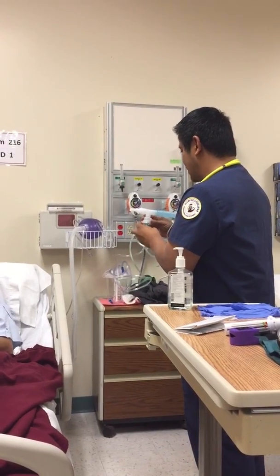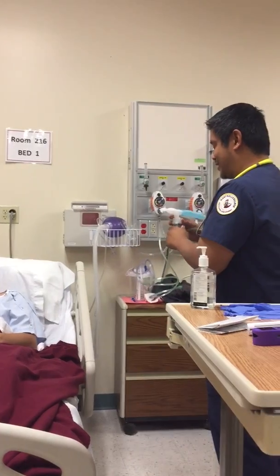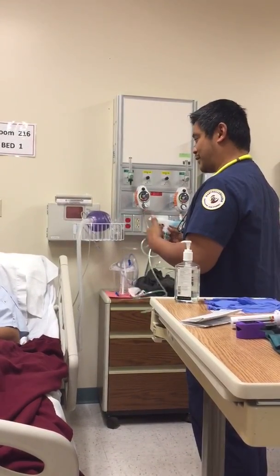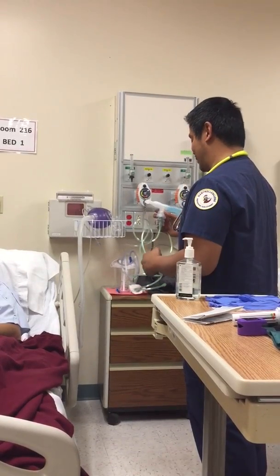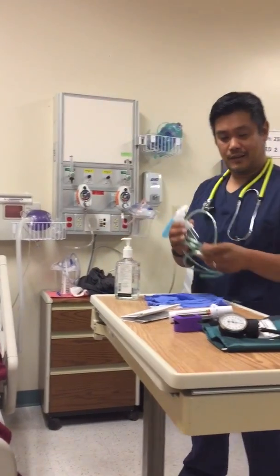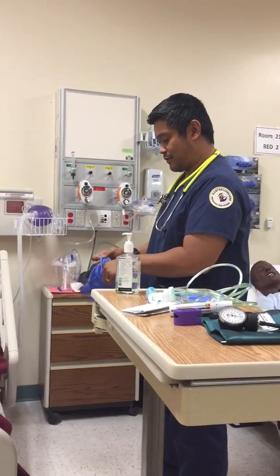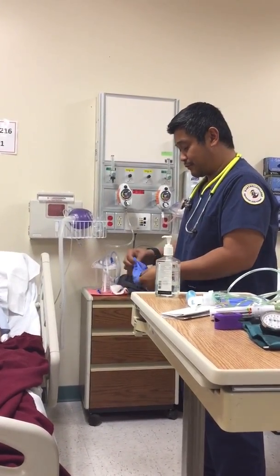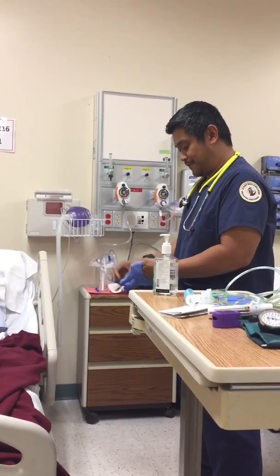All right. Do you have any questions? It's not going to hurt. You're just basically going to breathe in like you would normally do, and every fifth breath you're probably going to go ahead and do a deep breath that will allow the medication to get a little bit deeper into your lungs. All right. So first off, we're going to be doing your vitals, checking your heart rate, your blood pressure. Check your oxygen levels as well.